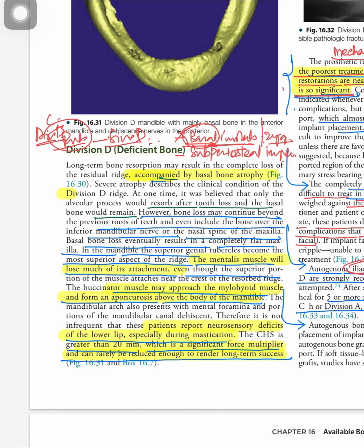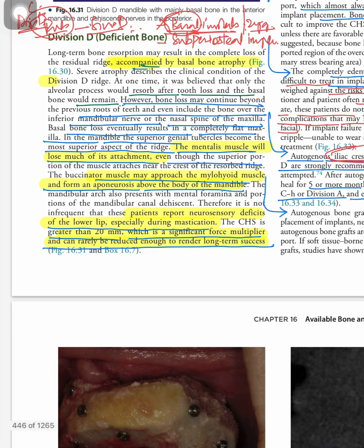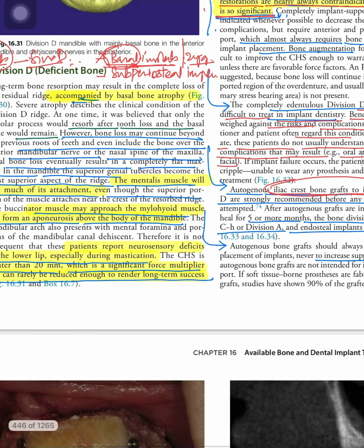This part I missed out. So, even a sinus elevation and placement of root form implants is an option in case of posterior maxilla. But again, with severely reduced or atrophied maxilla, even the predictability of sinus elevation reduces.